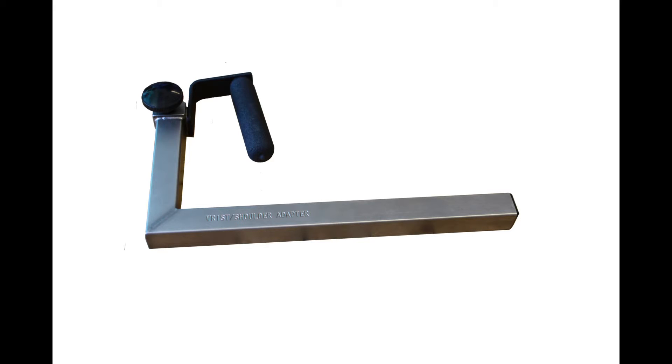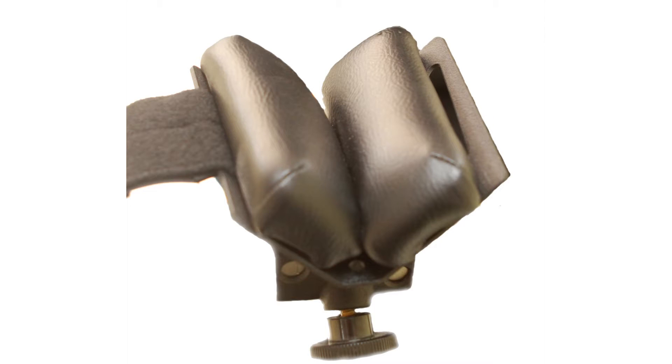Collect the adapters and stabilizers for this test. We will need the wrist shoulder adapter, the forearm stabilizer V-pad, the thigh forearm stabilizer tube, and the lumbar cushion may be required for comfort.